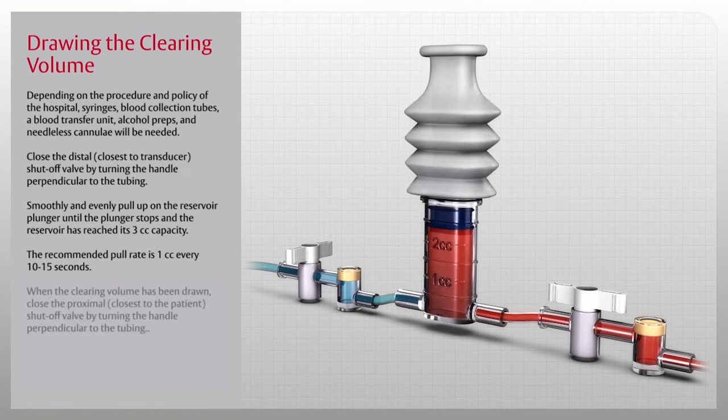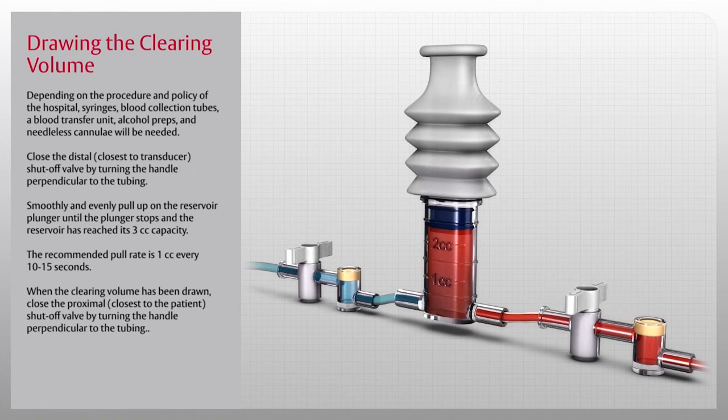When the volume has been drawn, close the proximal shutoff valve by turning the handle perpendicular to the tubing.